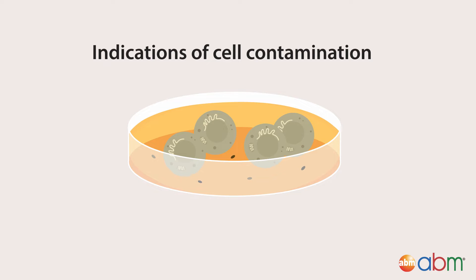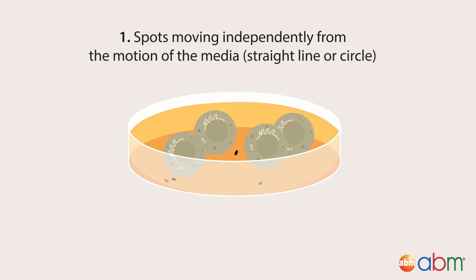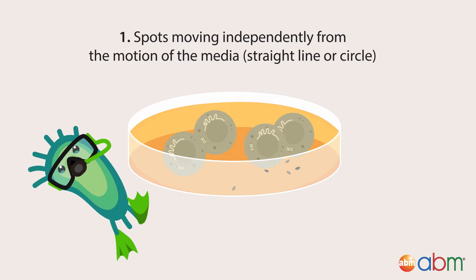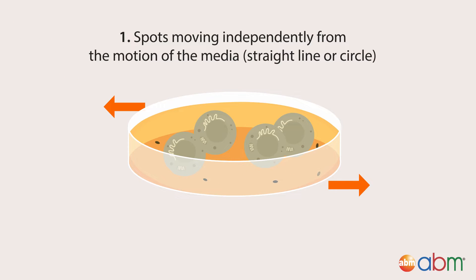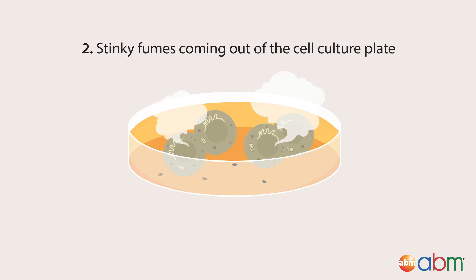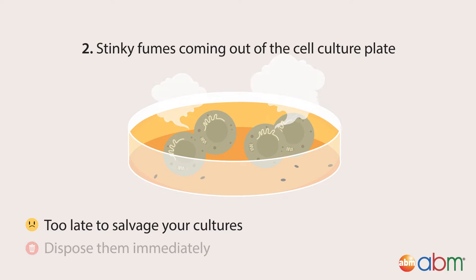Here are indicators that the black spots may actually be bacterial contaminants: if the dark spots move independently from the motion of the media. All particles jiggle at high magnification due to Brownian motion, but many bacterial contaminants do actually swim. If you see a particle moving any distance in a straight line or circle, you're likely looking at bacterial contaminants. If you smell something funky, when bacterial contamination is full-blown it will start to smell. At this point, it is too late to salvage your cultures and they should be immediately disposed of properly to avoid spreading the contamination.